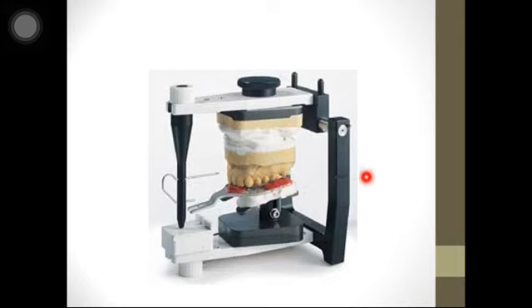Maxillomandibular records are those records which are placed between the upper and lower jaw of the patient, like any kind of wax or impression compound. Both upper and lower teeth impressions are recorded in that recording medium, and then the lower arch is mounted on the articulator. This concludes today's lecture.